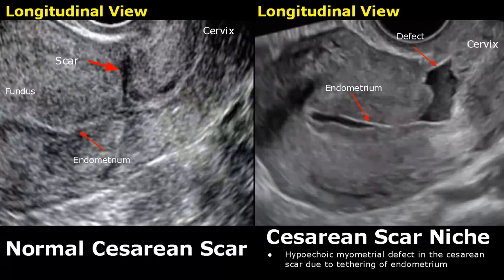This is another image of a normal caesarean scar. It is a hypoechoic line in the myometrium.